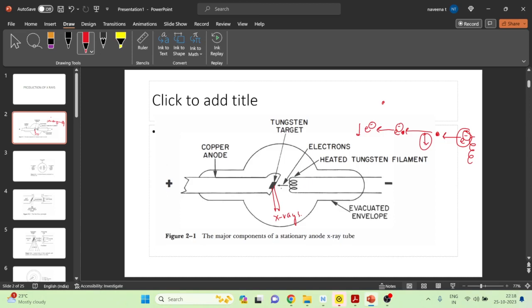So as a result, the gas is removed from the X-ray tube, and now X-ray tubes are mainly produced with vacuum. Inside the glass enclosure there are the cathode and the anode, and both are suspended in the vacuum. The size and shape of the X-ray tubes are designed to prevent electric discharge between the electrodes.